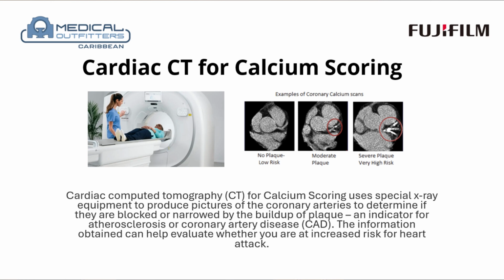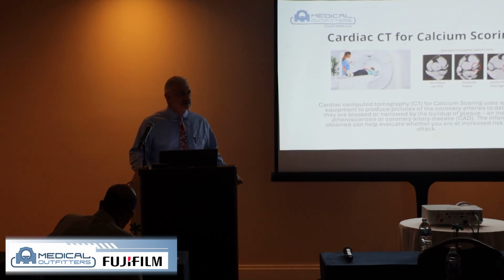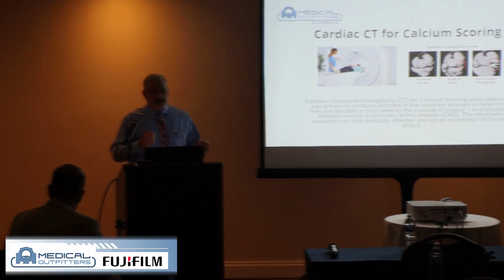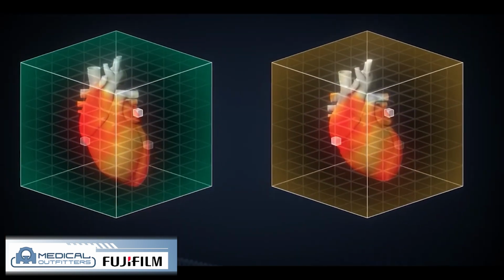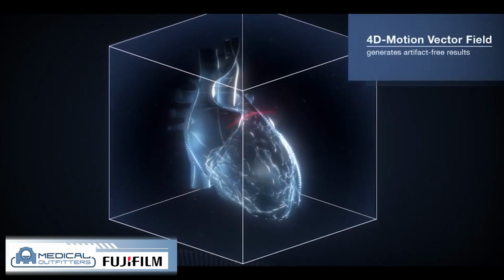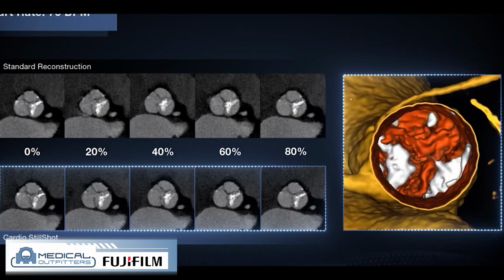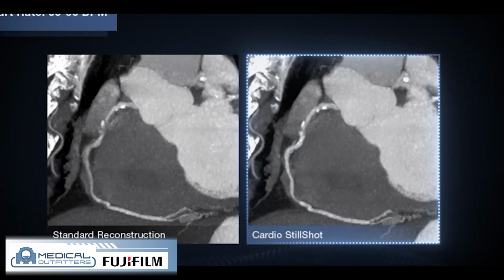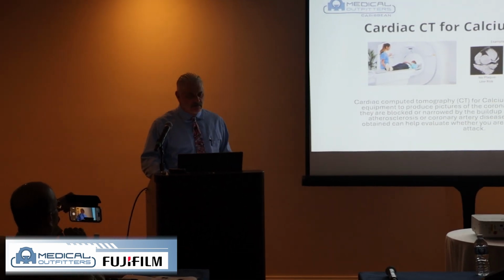years on the 4-slice, the 8-slice, the 16-slice. It basically gave clinicians an idea of how much atherosclerotic disease was present. And atherosclerotic disease doesn't necessarily mean that there's a stenosis or soft plaque, but it's usually a good marker. Using the CT scanners, and now we're using 64s, 128s, 256s, 360s, whatever it may be, typically a 64-slice gated study does a beautiful calcium score.